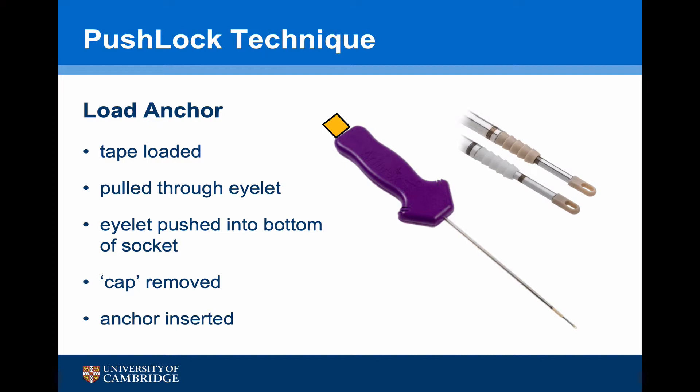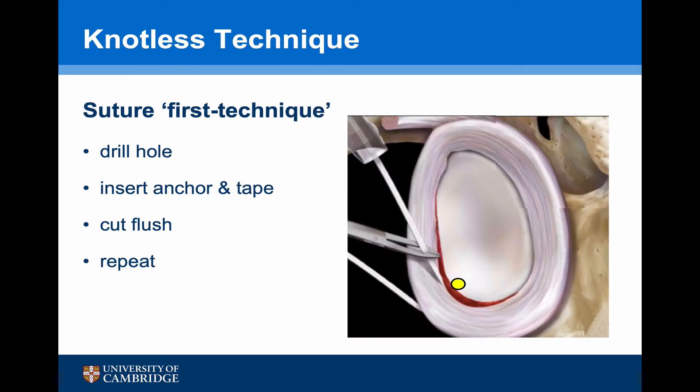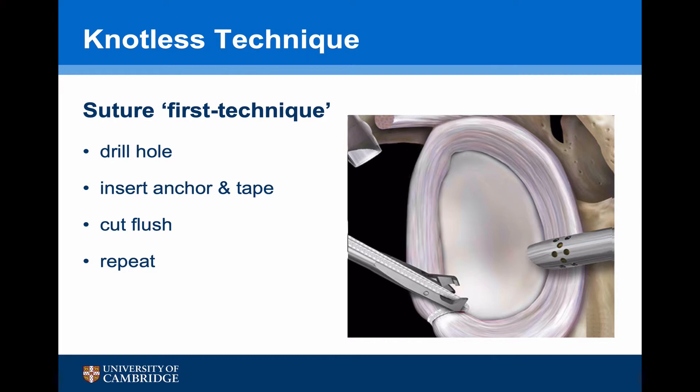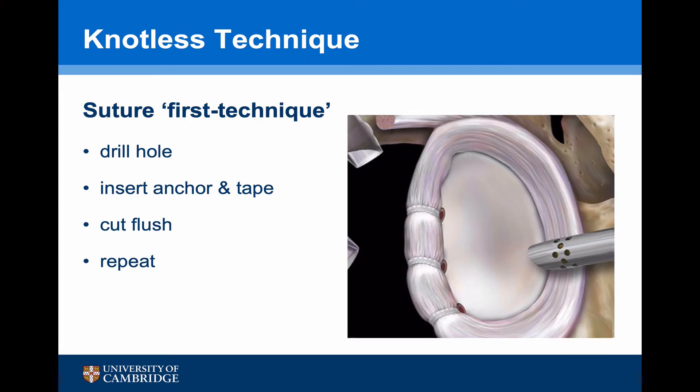Having loaded the suture tape, the eyelet and central core of the introducer need to be pushed down into the bottom of the drill socket. Once the eyelet is at the bottom, the orange cap can be removed from the introducer and the outer tube on the introducer will knock the anchor down so that it will dock directly with the eyelet. The suture tape has been loaded and the eyelet is pushed down to the bottom of the drill socket. Once knocked into position, the orange cap is taken off the introducer and the anchor itself is pounded into the socket. This pulls up the labral tape, getting a nice fixation and shift of the labrum. Once secure, the suture is cut flush using a tape cutter. This is then repeated for the second and third anchor.